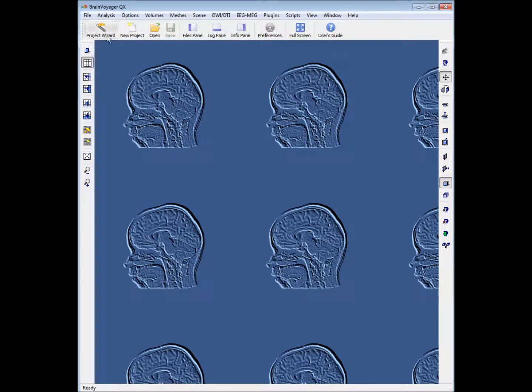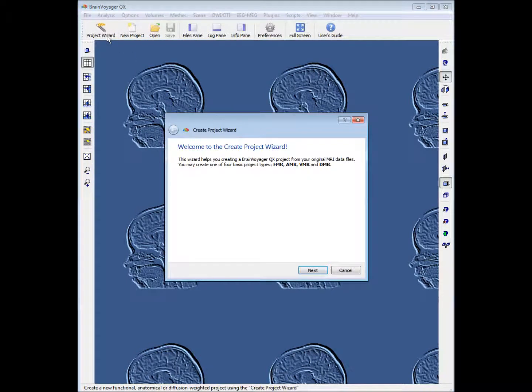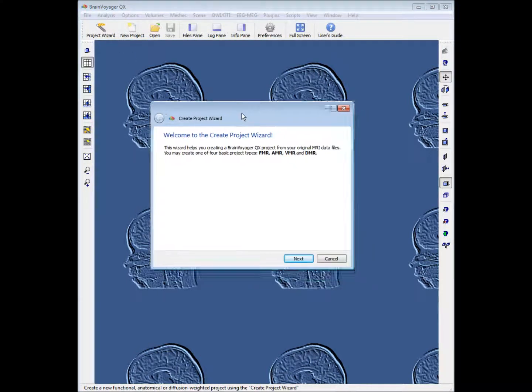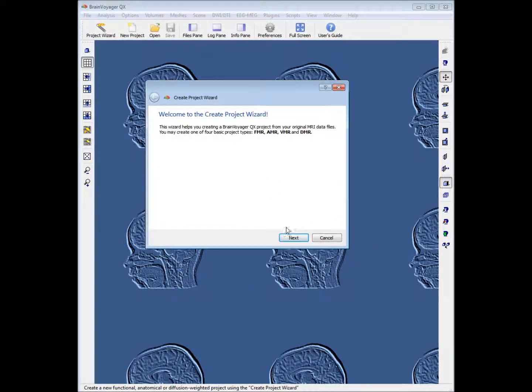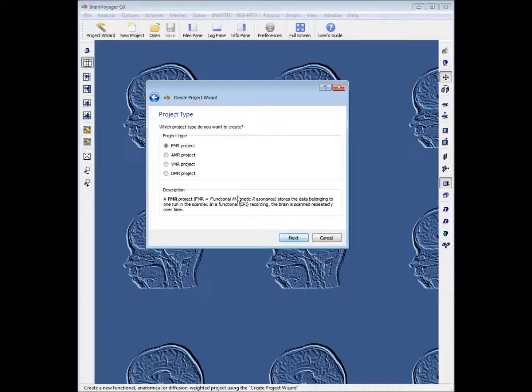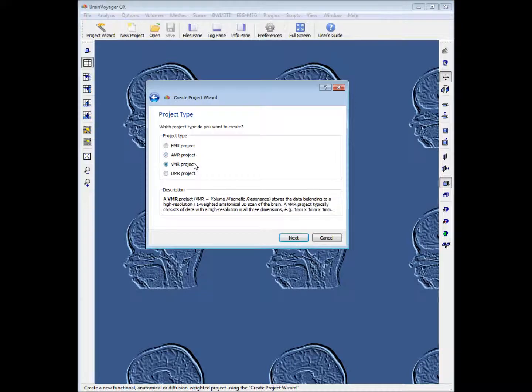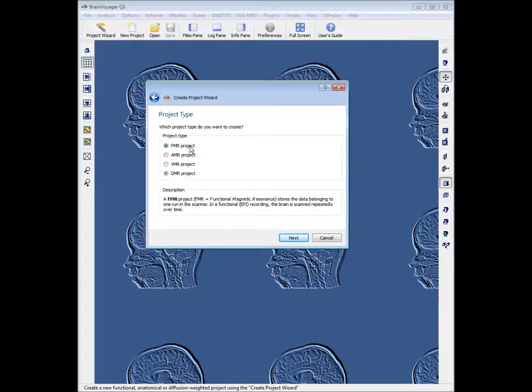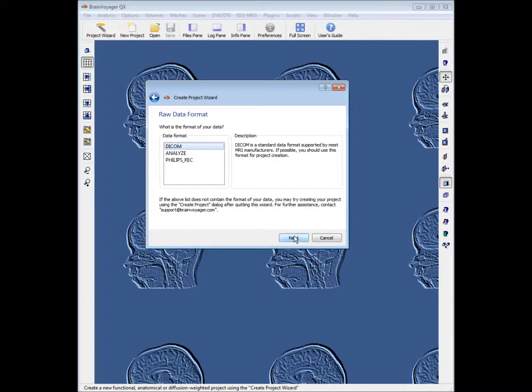The first thing you want to do is click on Project Wizard. You're given a number of options — you can click through these to see what they're about — but the one we are looking for is FMR Project, so we'll select that and click Next.